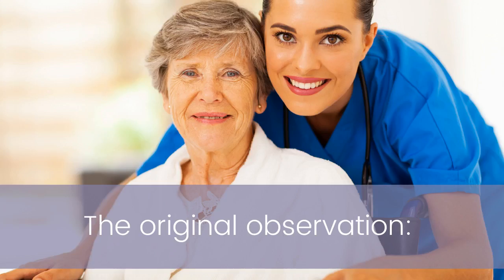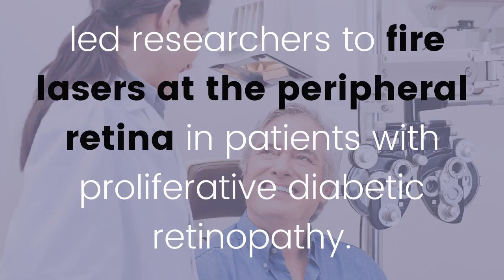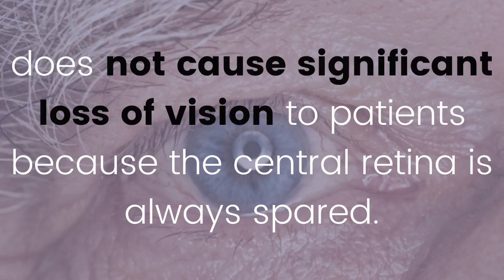The original observation, that proliferative diabetic retinopathy did not tend to occur in patients who had peripheral scarring in their retinas from other conditions, led researchers to fire lasers at the peripheral retina in patients with proliferative diabetic retinopathy. This led to peripheral scarring, and as a result, the abnormal blood vessels that grew in the retina shrunk and disappeared. Firing a laser at the peripheral retina and scarring it does not cause significant loss of vision to patients because the central retina is always spared.